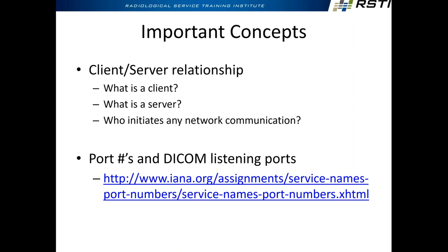And when you're configuring the software, you can be either client or server. Knowing which side of the role you're on depends on what you're trying to accomplish in the troubleshooting.